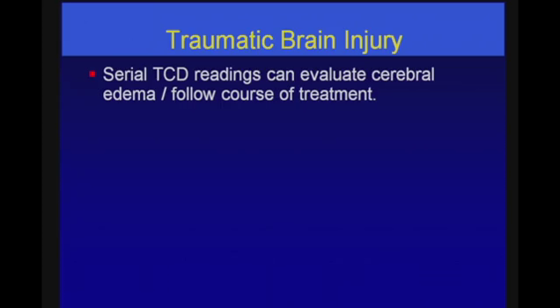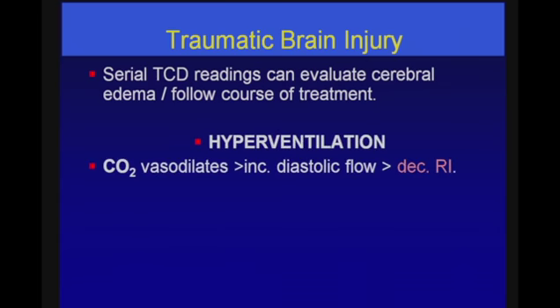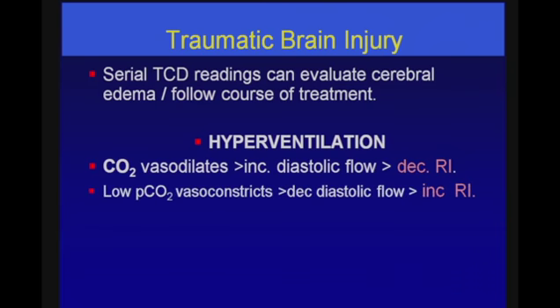So serial TCD readings can evaluate how severe the edema is and follow the course of therapy. We can see if there is vasoreactivity. If there is reaction to hyperventilation, that bodes for a better prognosis than those who do not react to the hyperventilation tactics.